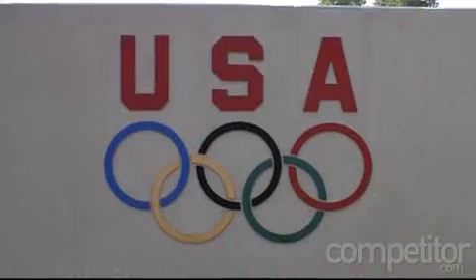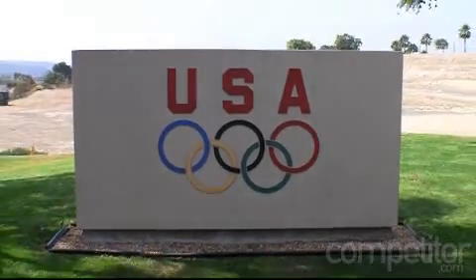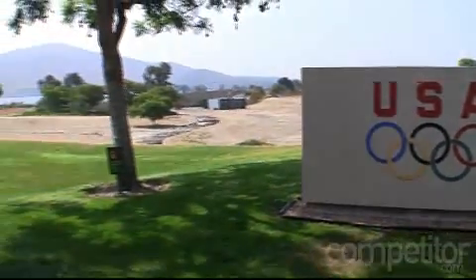Hello runners, this is Matt Fitzgerald with Competitor.com. I'm here at the Olympic Training Center in Chula Vista, California with Stacy Struble. She's an athletic trainer here, and she's going to take us through a quick demonstration of the machine you see behind us, which is a G-Trainer by Alter-G, an anti-gravity treadmill. Stacy, what is an anti-gravity treadmill?